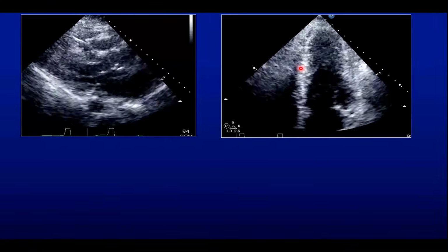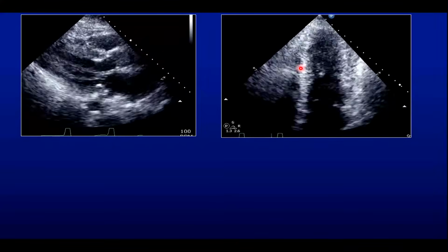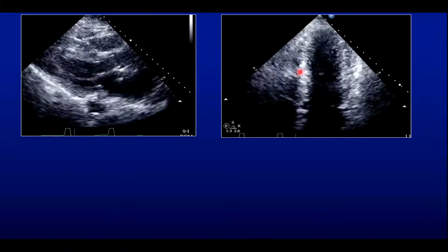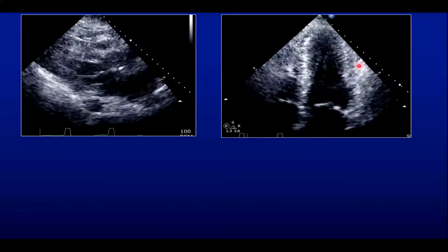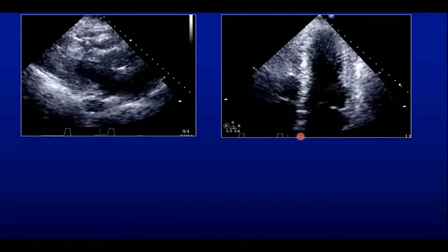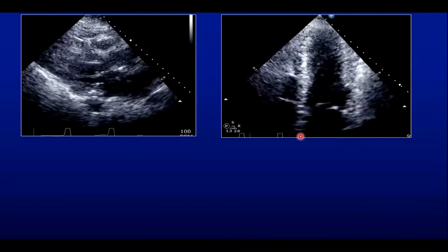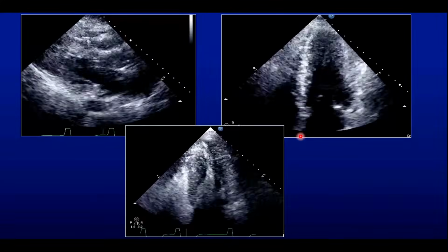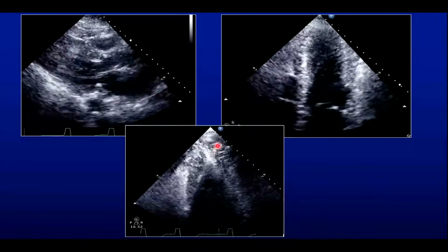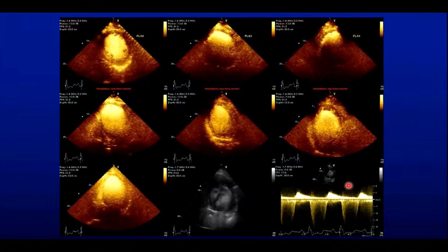If you don't have the epicardial movement in, the differential is either I have an akinetic segment or I have no place to go. So here, from this area of the septum upward, and even here, there isn't much motion of the epicardium coming in. So is there a lot of muscle here with cavity obliteration? Likely, yes. There is a suspicion, and this is where you would use contrast, and you could see some of the apex become obliterated, hypertrophic in this situation.